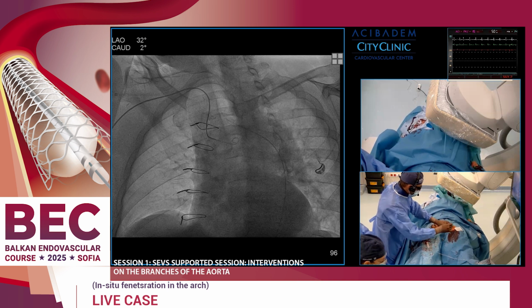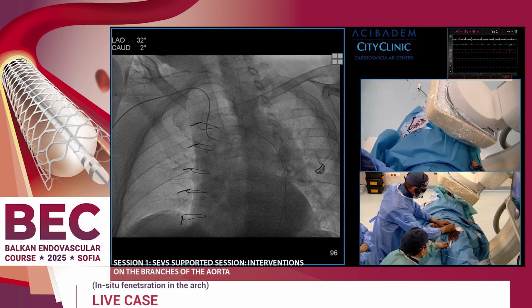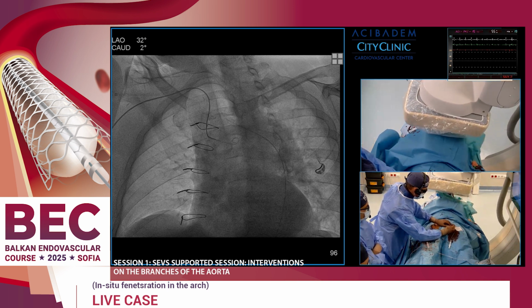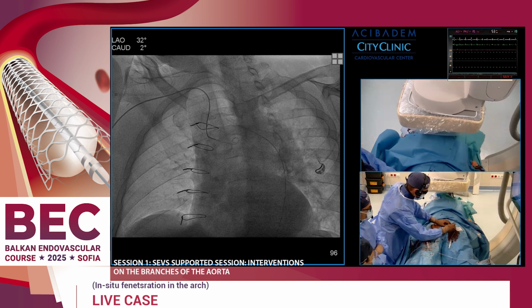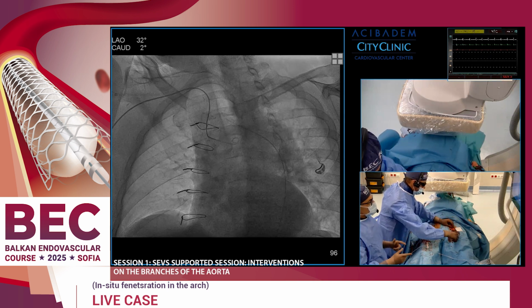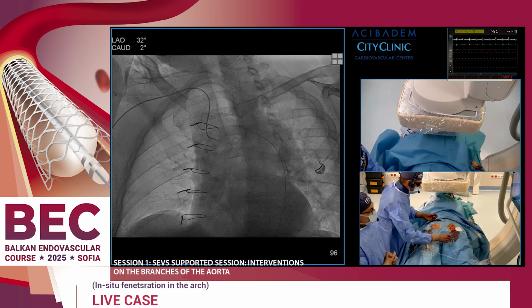Within the surgical graft implanted years ago over the coronary arteries in the ascending aorta. One of the most specific parts of the procedure is the preservation of flow into the brachiocephalic vessels. We are going to make a connection between a big femoral sheath and the left carotid and right axillary artery, in order to have a retrograde backflow from the femoral to the brain vessels.